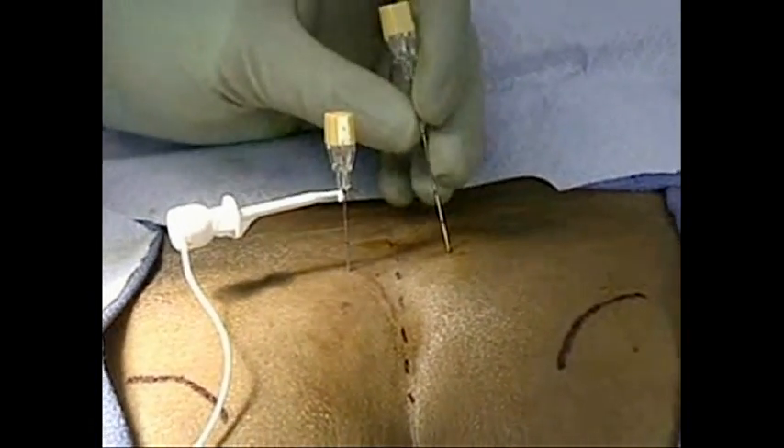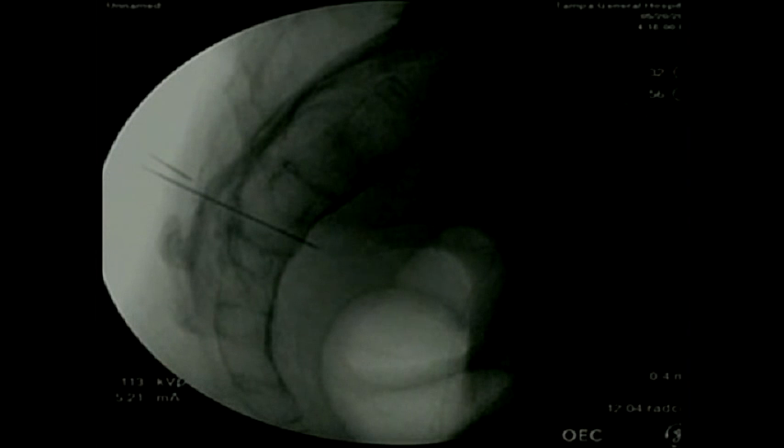Right now we're using fluoroscopy again. We're seeing him try to get into the foramen as we talked about before — trying to find that most medial upper part of that S3 foramen to get the best signal. The key is it's a fairly large foramen; you want to get as close to the nerve as possible so he uses the least amount of energy to get the best stimulation.